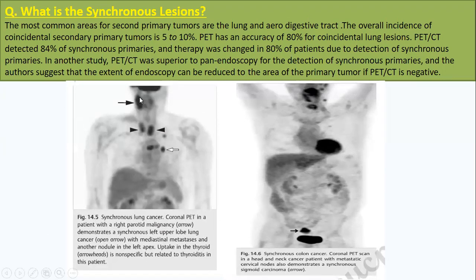Here are two examples of synchronous tumors: the primary lesion in the neck and a synchronous lung cancer. This is a coronal PET in a patient with right parotid malignancy, shown by the arrow, demonstrating a synchronous lesion in the left upper lung with mediastinal lymph nodes — also a metastatic lesion. The uptake in the thyroid gland is incidental but not specific, mostly related to thyroiditis.